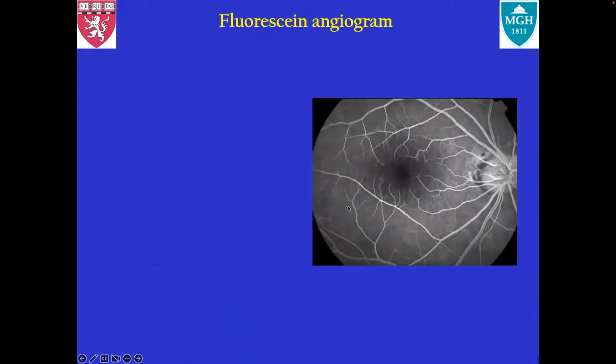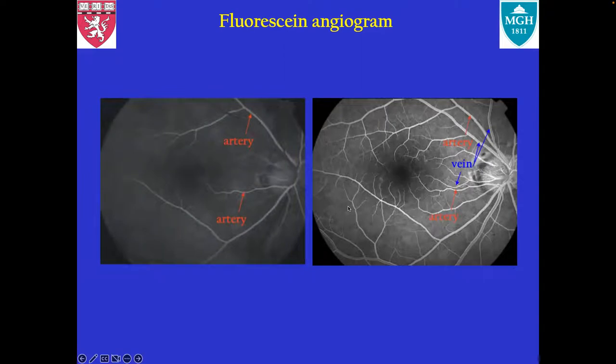Don't worry. So this was a verification of that experiment. Remember that I explained about the indocyanine green, or the fluorescence, that you could inject in your bloodstream, and then you can determine what's an artery and a vein. Based on that time sequence, at the short time delay the arteries light up, and when you wait until both arteries and veins light up, you can determine which one of these two is an artery and a vein.